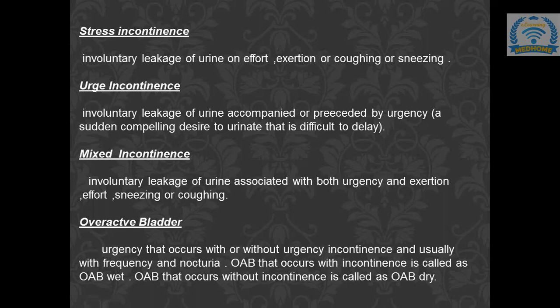Am I clear? All the four definitions are clear to all of you? Because they will be helping us to study the graphs of urodynamics. Yes, ma'am. Thank you for that. And the most common type of incontinence is stress incontinence. Okay.